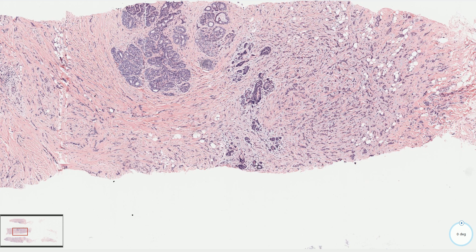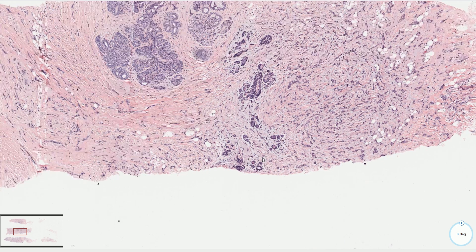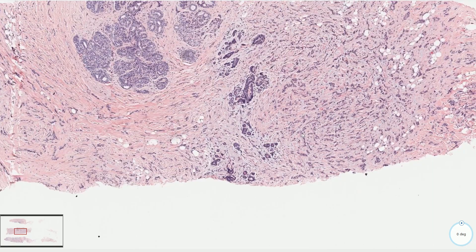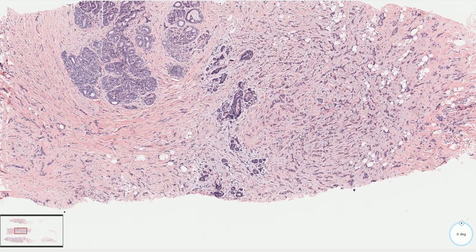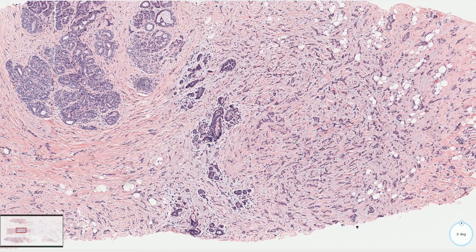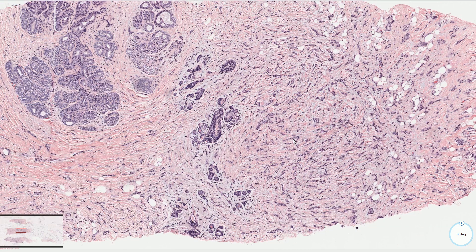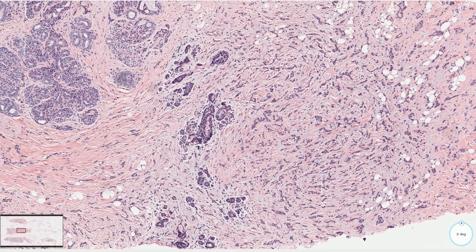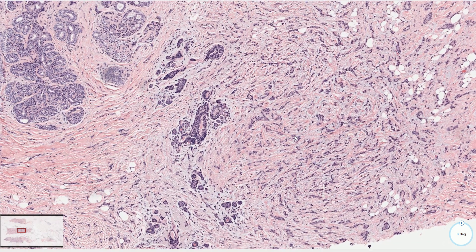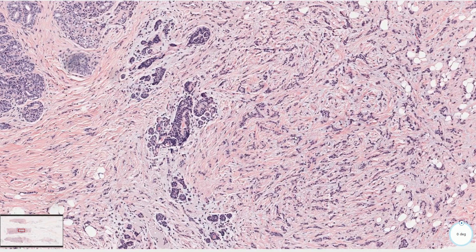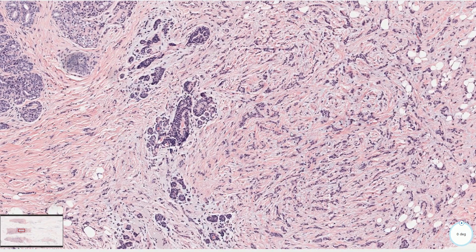It was initially described as a tubular variant of lobular carcinoma. However, the expression of cellular adhesion molecules like E-cadherin and several catenins supports the classification as a separate special type of carcinoma.